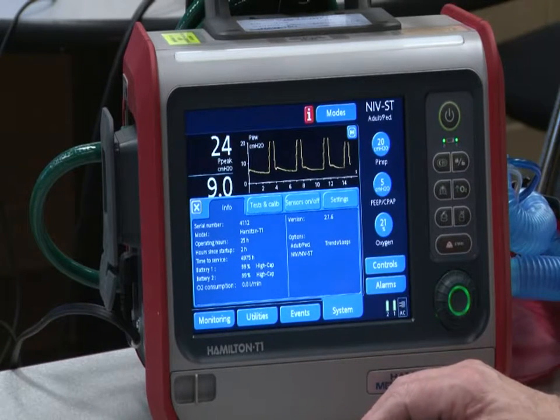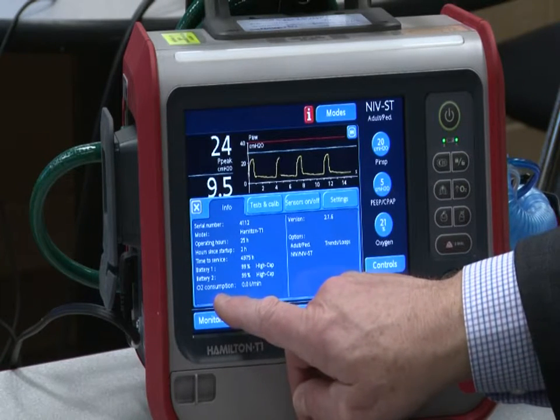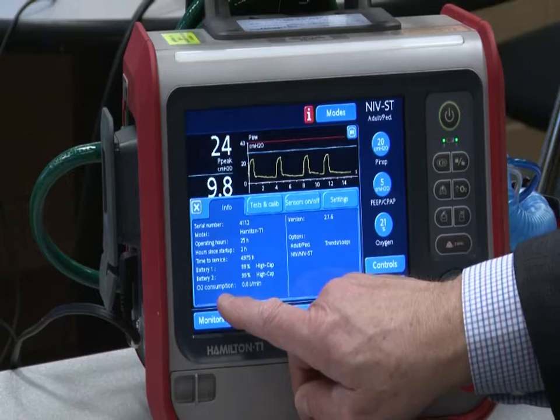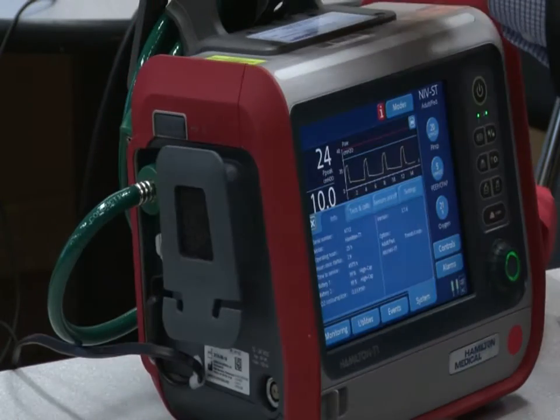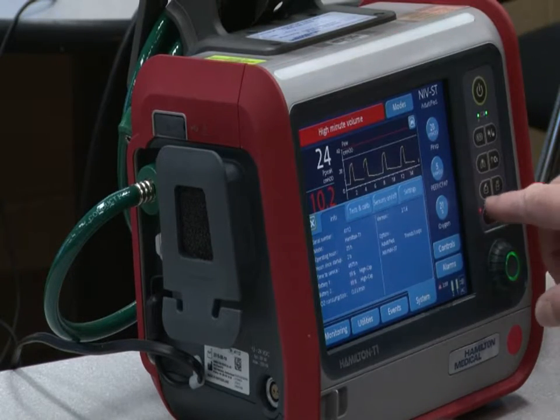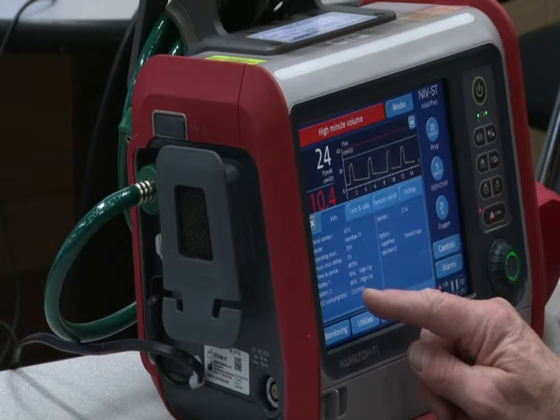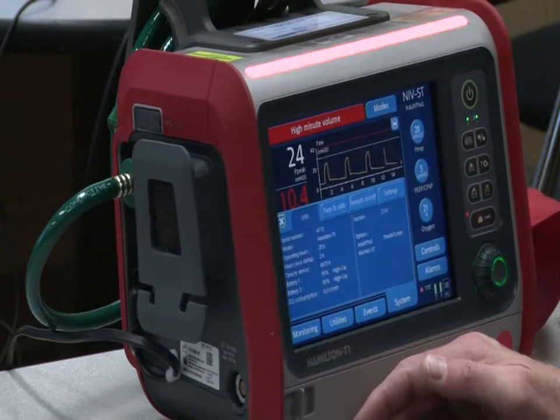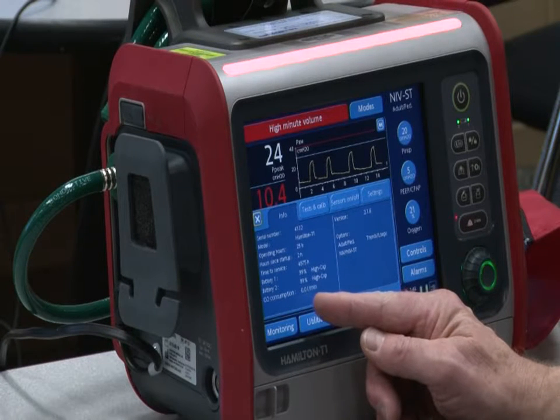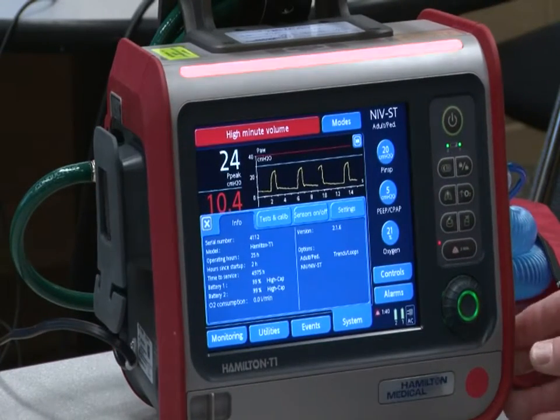Another thing, if you go to the Systems tab and you look in the bottom left-hand corner, there's a switch that we've turned on for you. It says O2 consumption. If you're using, which you will 99.9% of the time, the high-pressure hose connected to a tank, after 2.5 minutes of running the ventilator, it will produce a number based on the I time and the FiO2 and the rate and all that kind of stuff, the minute volume. Mine's saying 0 now because we're on room air. But it will produce a 3, 4, 5, whatever number, 3.5.